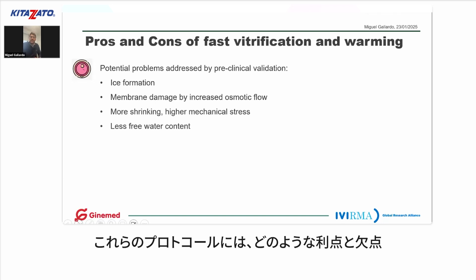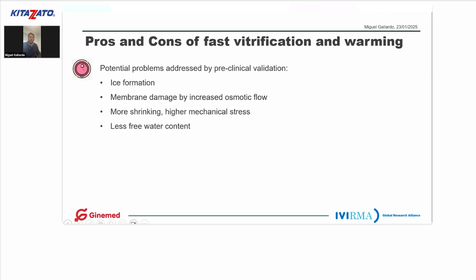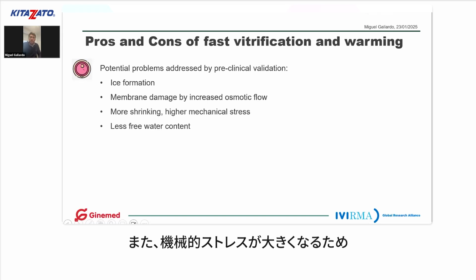And just to finish, what were the perils, the possible cons or potential problems of these short protocols? I mean, we would be afraid of ice formation, but based on the technical validation, we can see that if it survived, there wasn't much ice that formed. There could be membrane damage by increased osmotic flow.